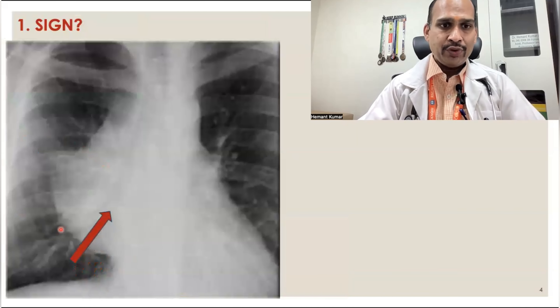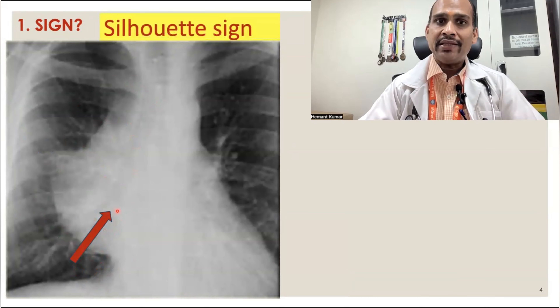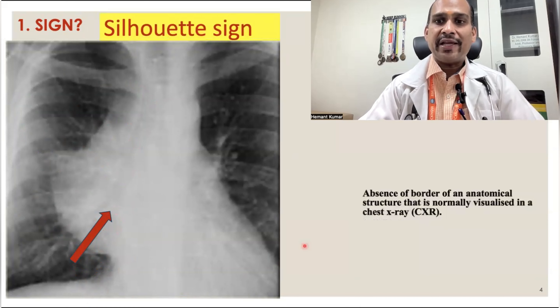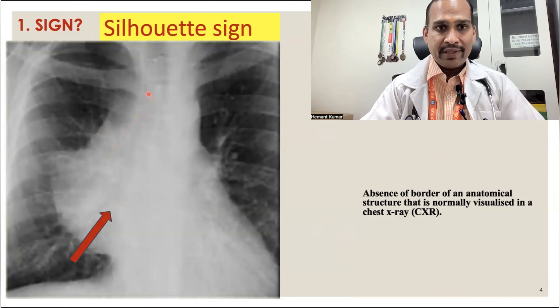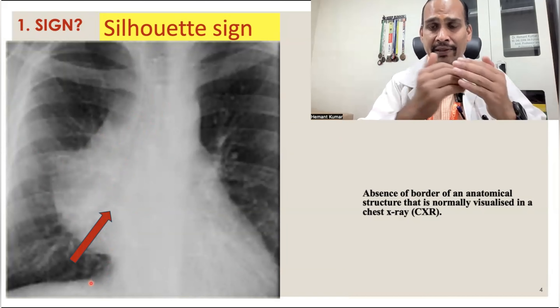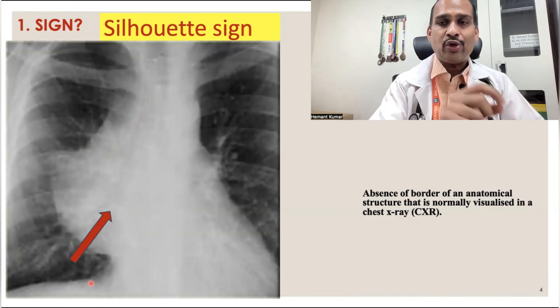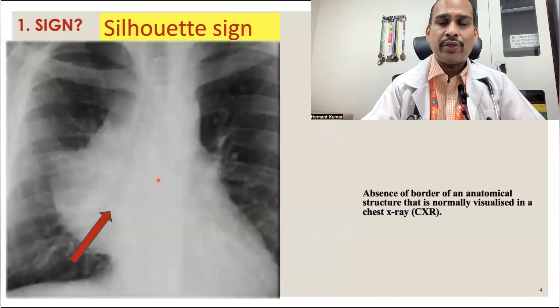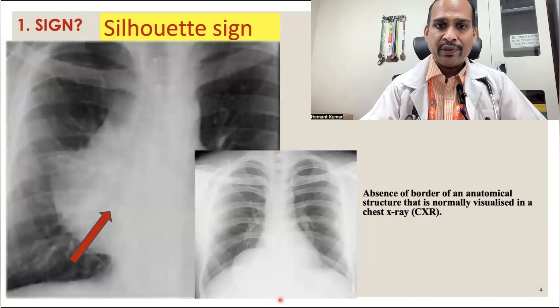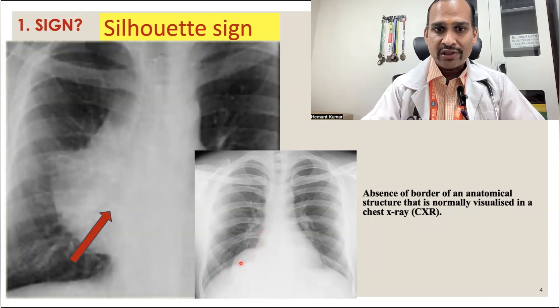Sign 1 is the Silhouette sign. If you see carefully, there is opacity on the right side. The Silhouette sign is the absence of the border of an anatomical structure normally visualized on a chest X-ray. In this opacity, we cannot make out the right heart border. Whenever there is obscuring of a normal structure — like the diaphragm, heart, or mediastinum — and we cannot make out a clear border, this is called Silhouette sign positive. In another X-ray, there is opacity, but it is not silhouetting the right cardiac border or the diaphragm — both borders are clear. That means the Silhouette sign is negative there.